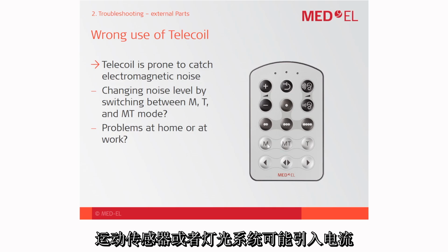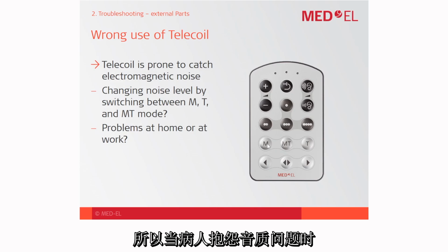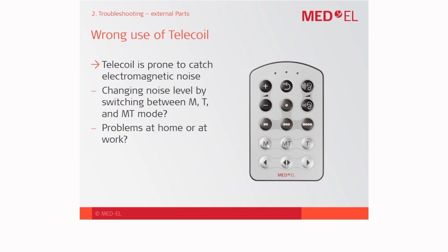So this could be caused by motion detectors or also light systems, and they could then induce currents which are then experienced as background noise, as distortions. So really make sure that when the patient reports sound quality issues, that the processor is not operated in the telecoil mode, because this telecoil mode is prone to catch electromagnetic noise.